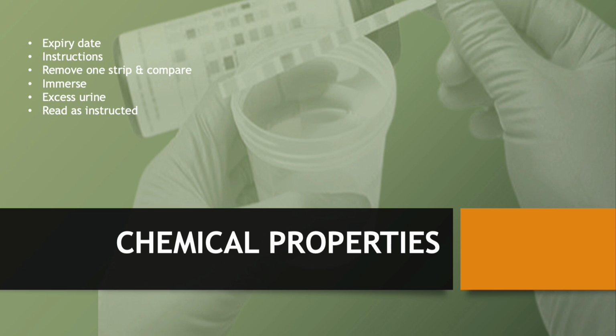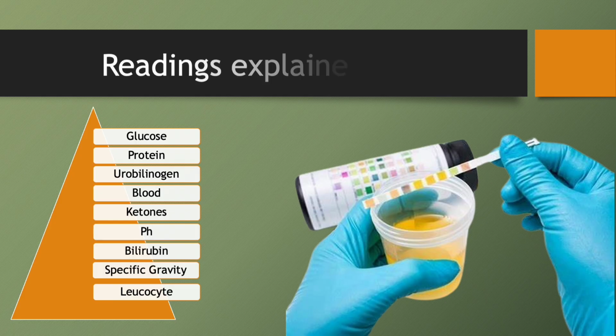After waiting the required time, read the reagent strip, comparing to the urine strip container. Once done, record your findings on a scrap paper that you have and discard the urine strip into the waste plastic that you have near you. While you wait for your reading time to come to pass, explain the following to your assessors.